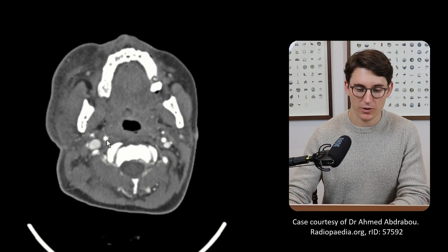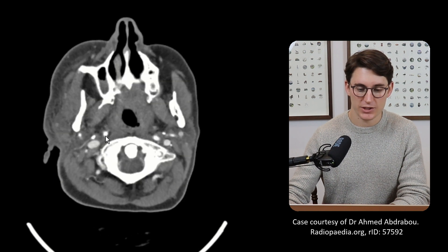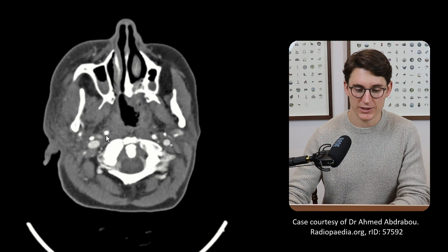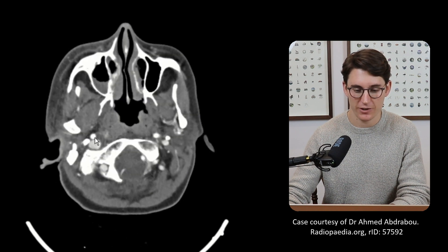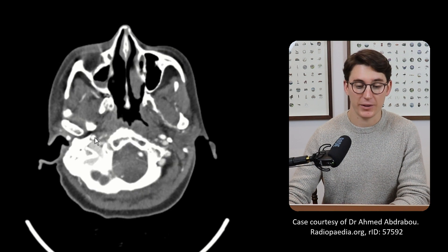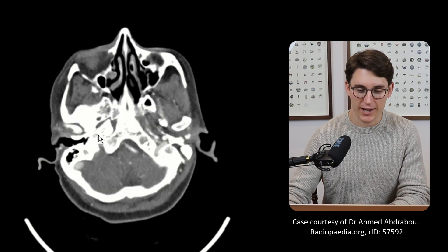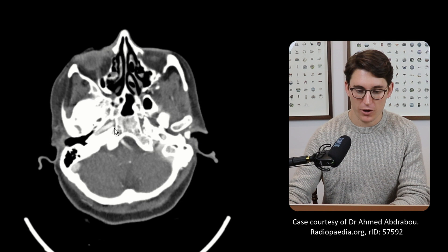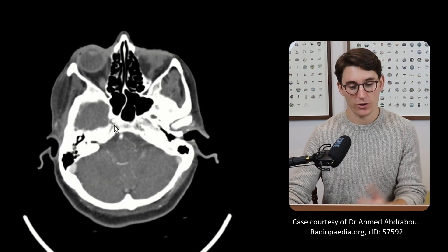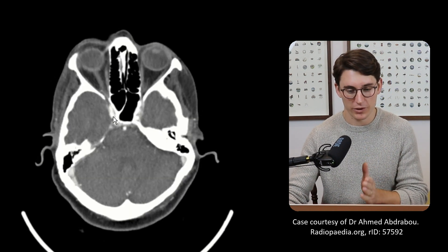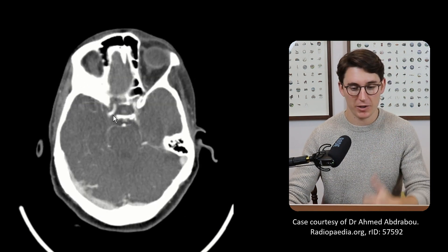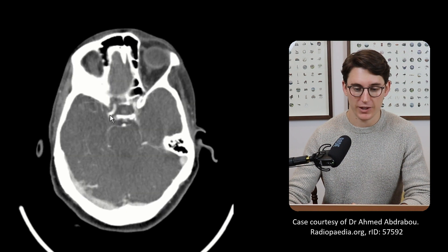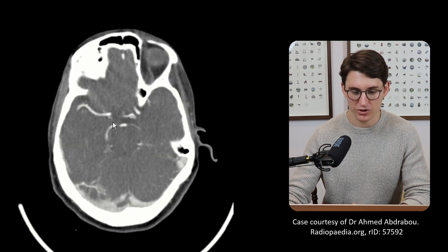We follow that internal carotid artery upwards. We can see our two vertebral arteries here, and our common carotid coming towards the skull base. Up into the carotid canal, anteromedially, past the foramen lacerum. We come further upwards and then dive forward, past or through the cavernous sinus, up past the anterior clinoids, coming backwards, splitting into our middle and anterior cerebral arteries. And we can just see our posterior communicating artery there.